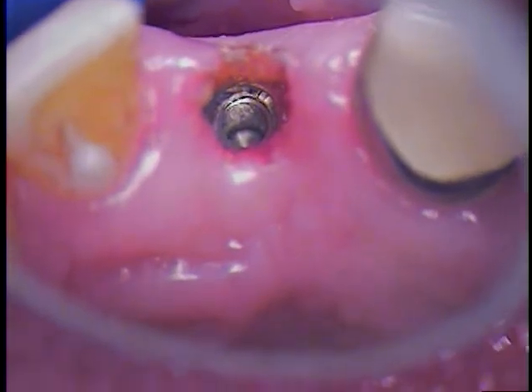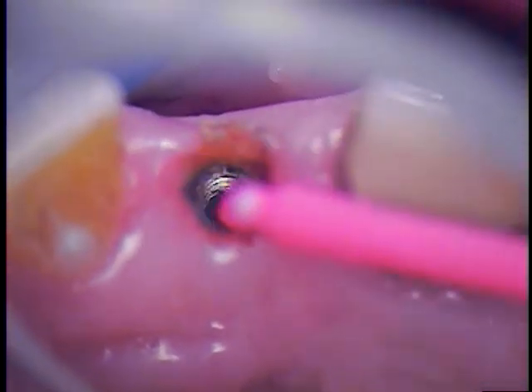It's just the tail end, the tip of a screw, but it's such a fragment, such a small fragment. It was hiding in the base, undetected, in the base of the fixture. We're thoroughly cleaning the screw threads now. These are very important threads. They're the fixture threads. All pristine, don't see any abrasions, no aberrations. They are fully intact.